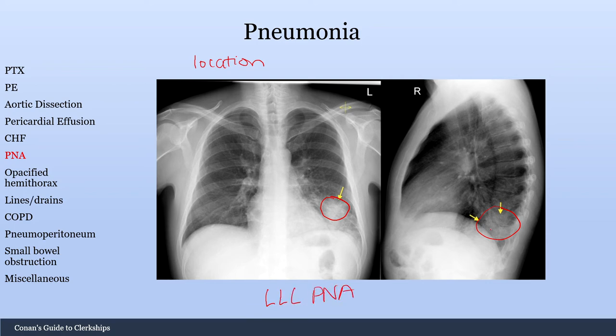This is a sign called the spine sign. On a normal lateral radiograph, the spine should get darker as it goes down. However, if the spine gets lighter or brighter as you go inferiorly, that's a positive spine sign — concerning for something obscuring the view in that area.